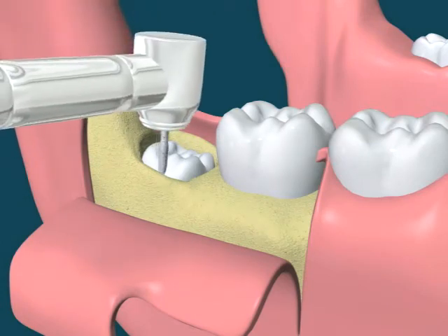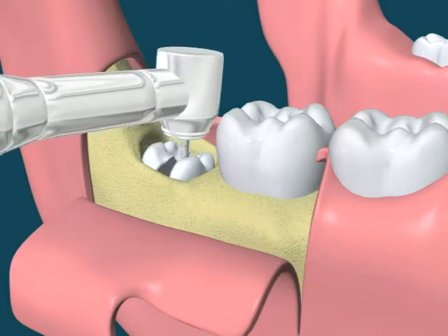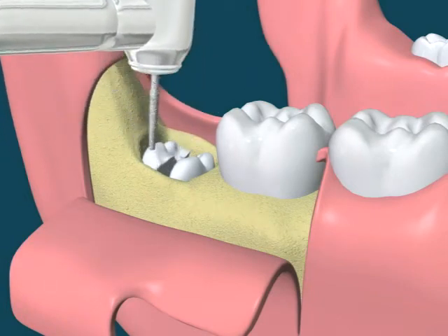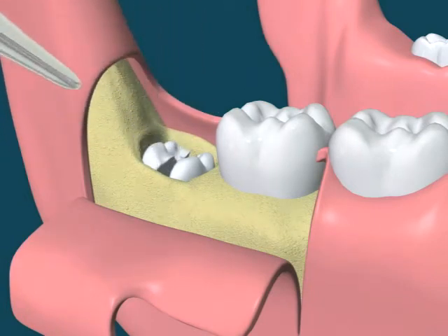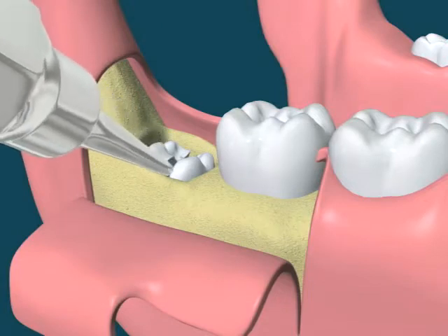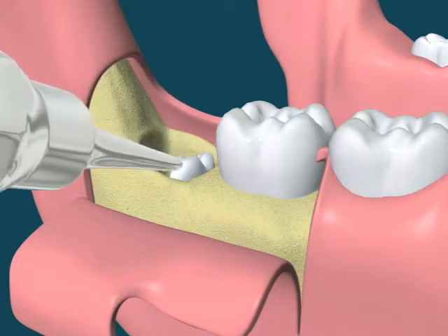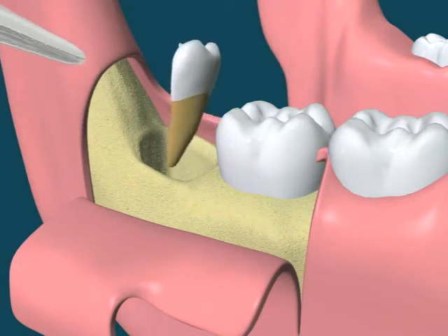The tooth is cut through and through. With the help of the root elevator, the parts of the tooth are dislodged and extracted.